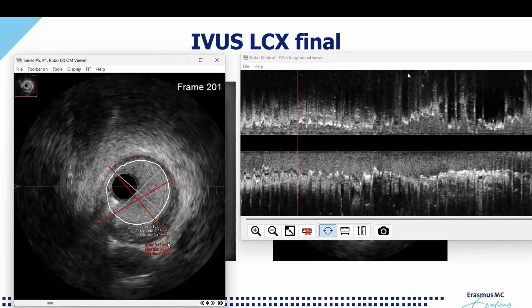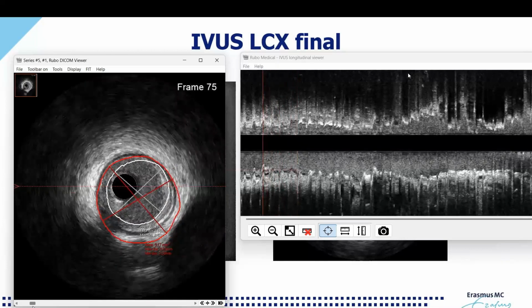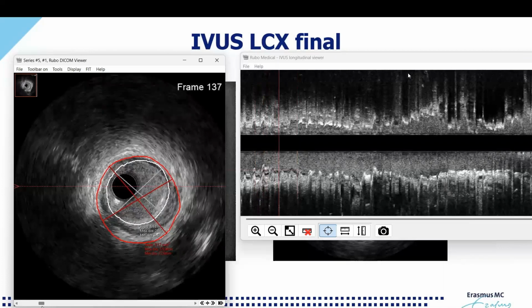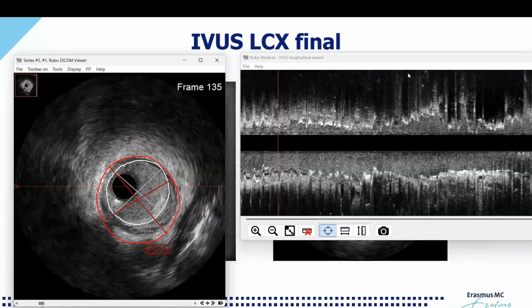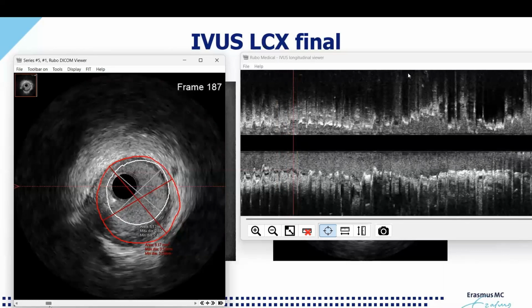Well, I see here, I did the plaque burden, 5.13. Yeah, so this is 40%. Yeah, 40%, less than 50. See, so this is what you want. In this case, this was as good as it gets. If you go a bit more distal, you can see that there's hardly any space where the plaque burden is less than 40. See here as well. Here it would have been perhaps even a bit better, but at the end, this is very much acceptable and nicely covered the dissection.